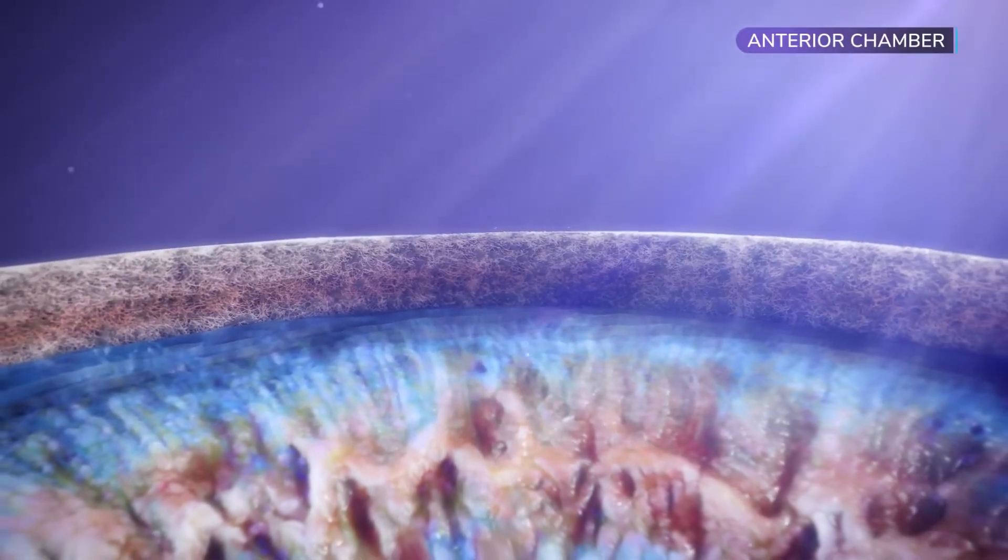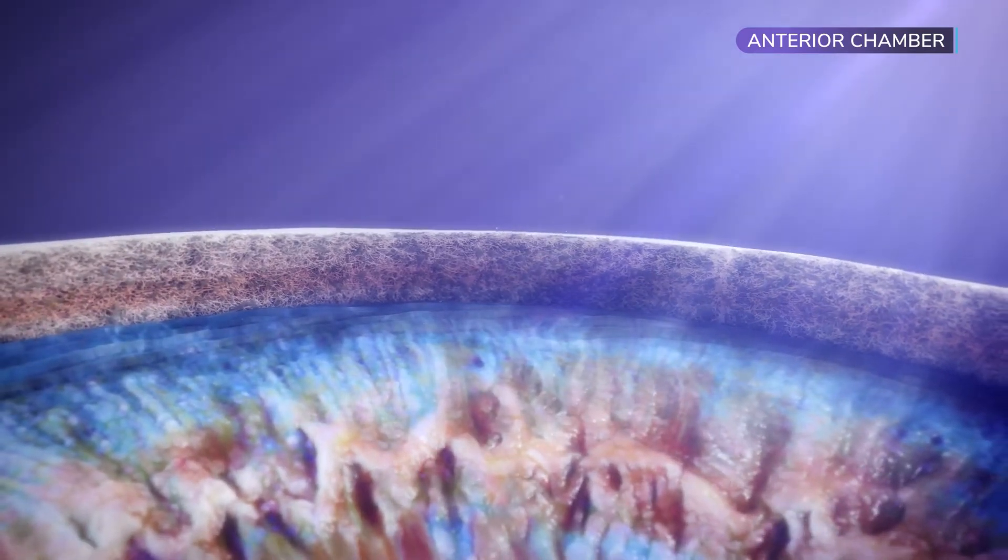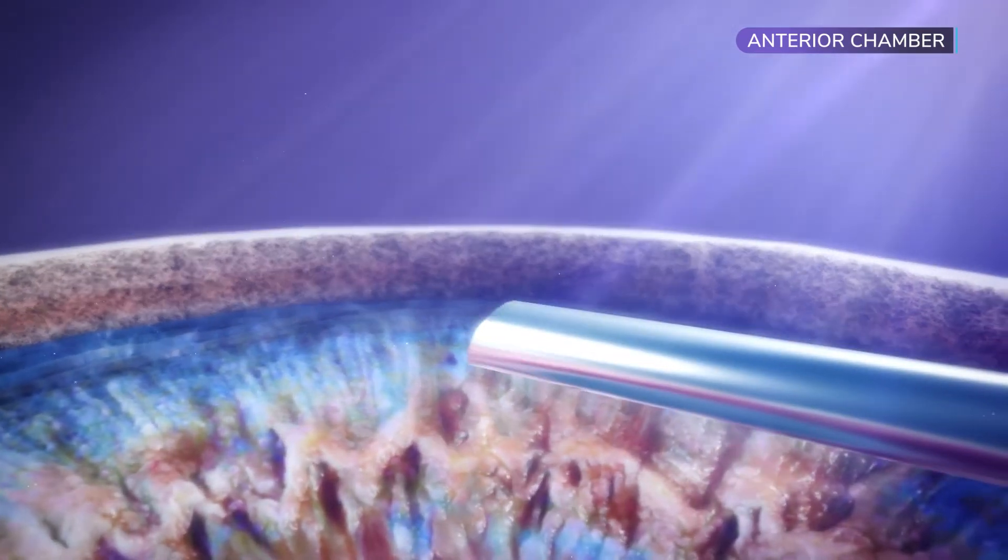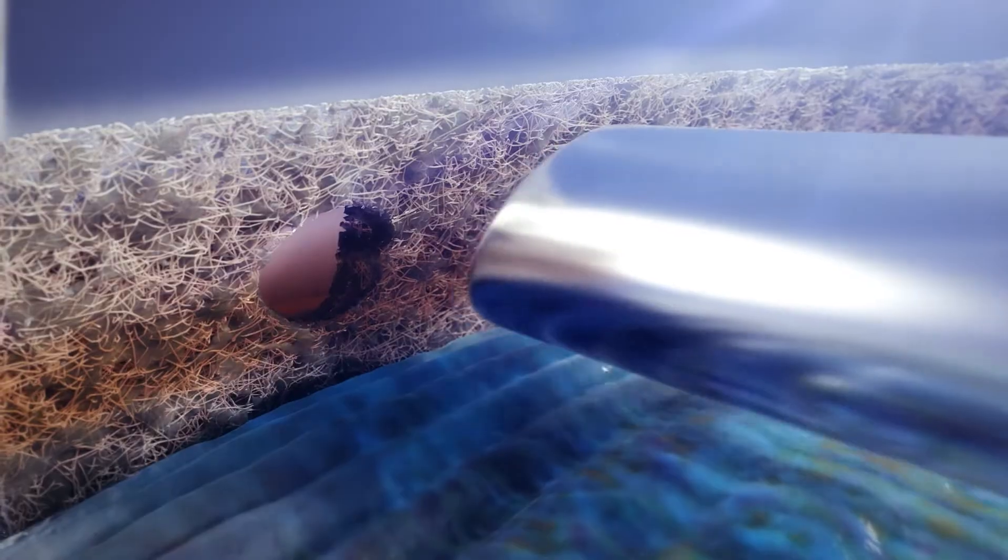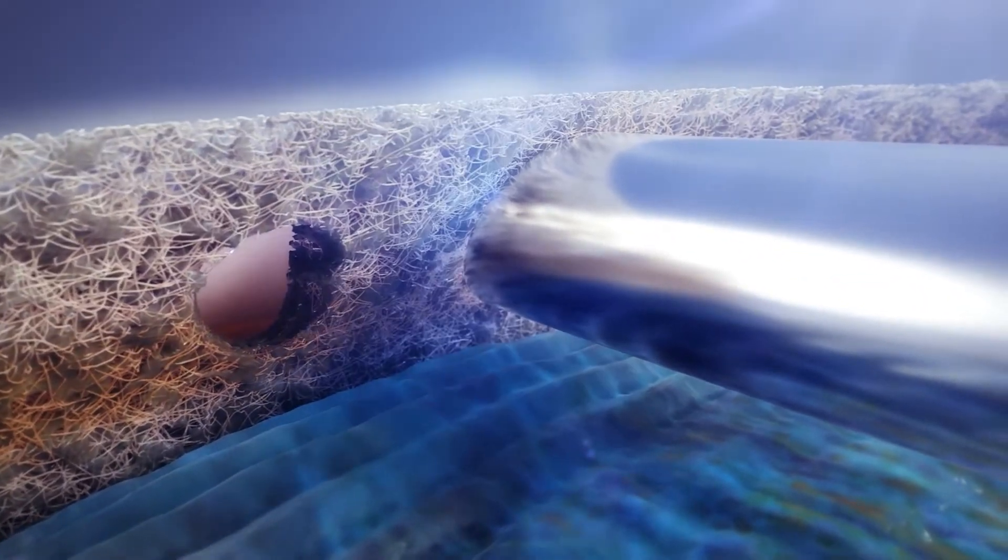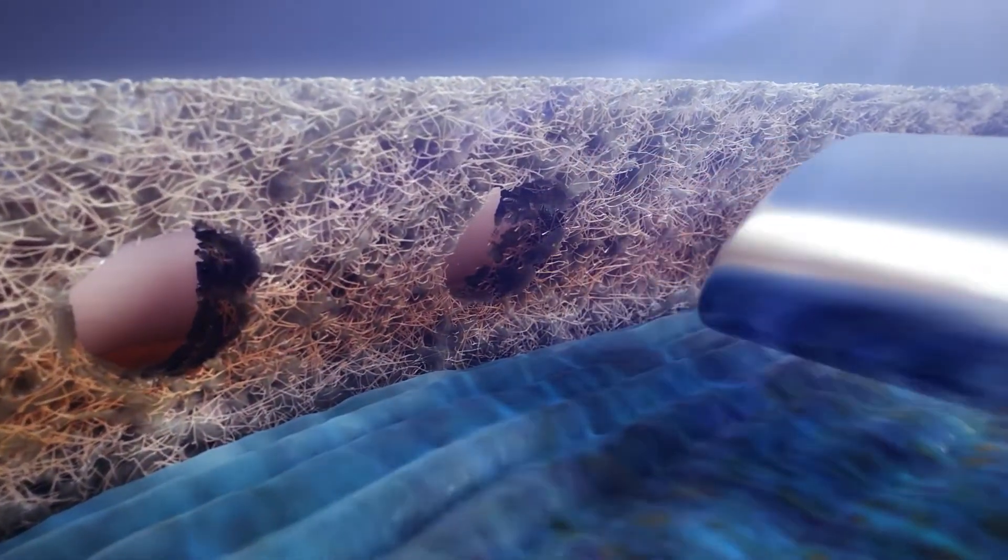Elios offers a new approach to glaucoma treatment. A probe inserted through a minimal corneal incision uses a high-precision non-thermal laser to create 10 microchannels in the trabecular meshwork. This improves aqueous humour drainage, facilitating a reduction of intraocular pressure.